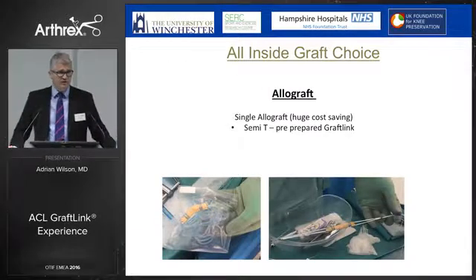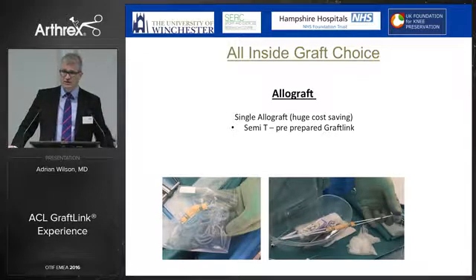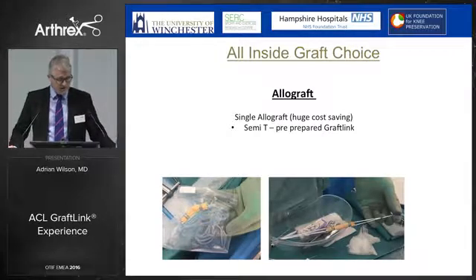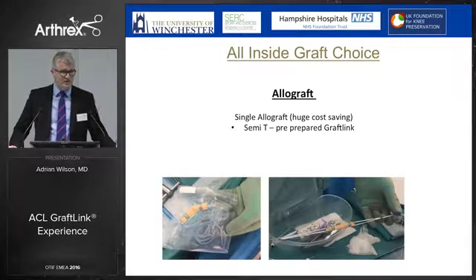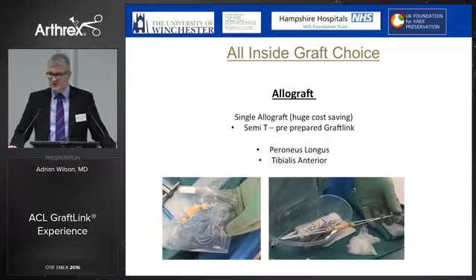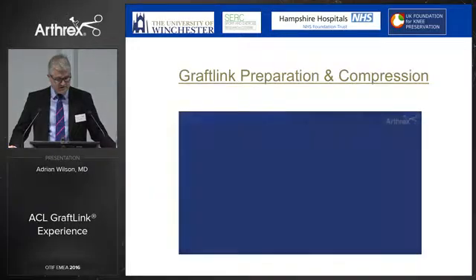So what about allograft? We do a lot of revision cases. I think this is a huge saving in my practice. We're using one allograft now as opposed to two, and they're approximately £3,000 in the UK, so it saves the hospital a huge amount of money to use just a single allograft. Arthrex UK, as well as the rest of Europe now, is supplied with these ready-made allografts, which literally come out of a packet, and it takes you a few minutes to prepare an allograft for all-inside ACL or PCL. For the PCL, we use the peroneus longus or tibialis anterior.